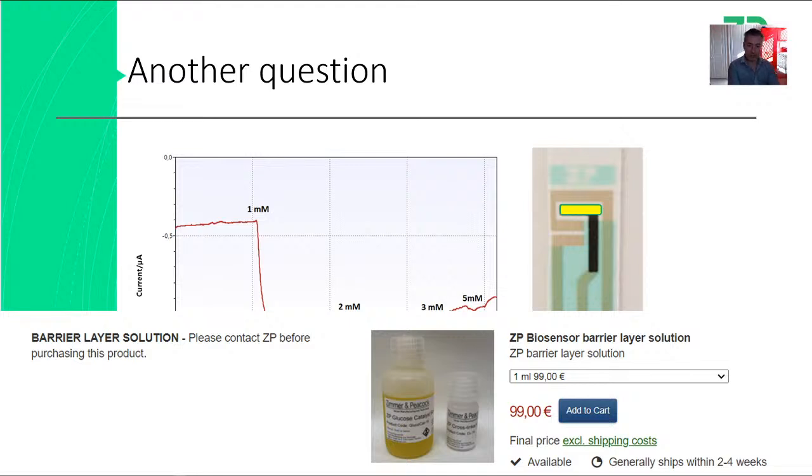But that is biosensing. You want certain features, but you have to compromise on other features. So you have to trade signal strength for linear range. The quick answer to these guys is, if you want your type 2 glucose sensor to have greater linear range, then put a barrier layer in, so you end up filtering a lot of the glucose, and you will lose signal, but you will get greater linear range.